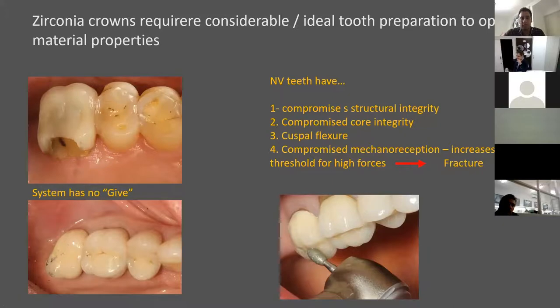So many teeth that I have seen in patients that had multiple crowns, what I'm finding is common when I ask them, do you know which is the zirconia crown? They're like, yeah, it gets in the way of my cheek and tongue. So buccolingually, obviously it's a lot wider and it is over contoured. And it's because of this over contoured hard rock, and you can't chip it, it doesn't wear type material that's over these substrates, which is the root, which often is the weak root, which has had endodontic therapy, that eventually results in fracture.